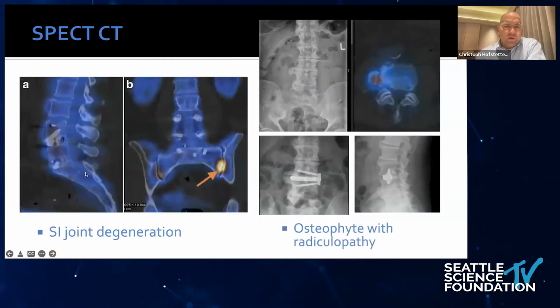Another thing is nice, as we've heard earlier about SI joint fusions, it really lights up at SI joint disease. And here's one of my patients that had a large lateral osteophyte that was lighting up the bone SPECT, and we just did a standalone extreme lateral interbody fusion, as here with the lateral plate. And so that's an application.